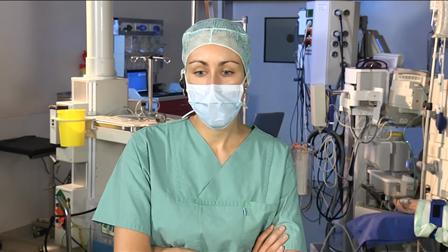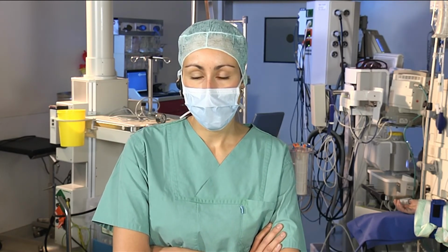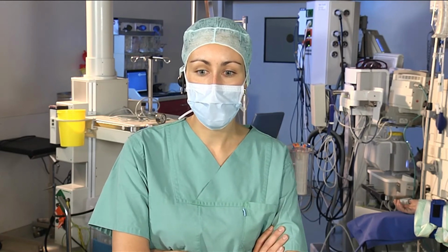Is this candy plug already commercially available, or is this a homemade product? Because this is a CMD device, yes, and it has to be ordered according to the patient anatomy.